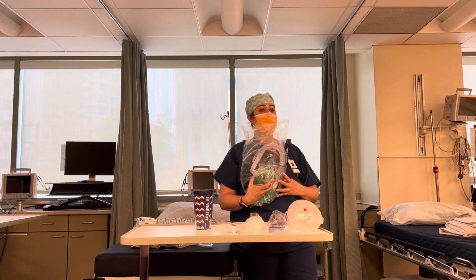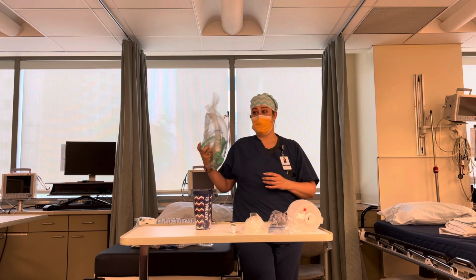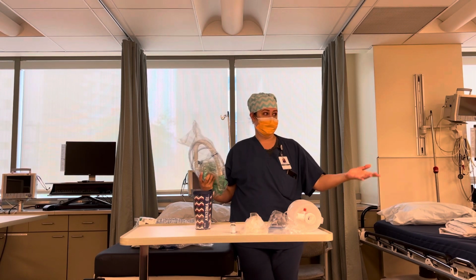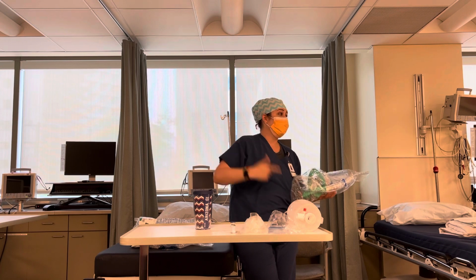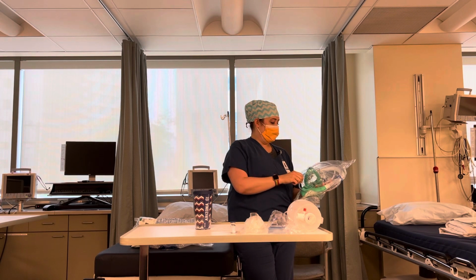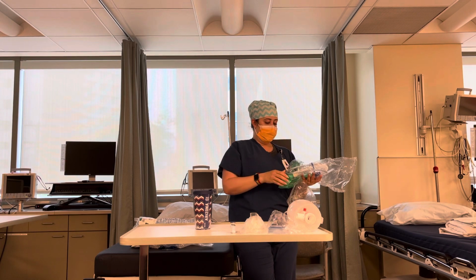I feel like I tell everybody who comes in the room, if we ask for a bag, we want this. Also called what? Jackson Rees, right. So it's our responsibility, if we ever use one of these, to get another one to replace it with, so it's always in the bottom of the cart. Put together, assembled, the mask should be there.